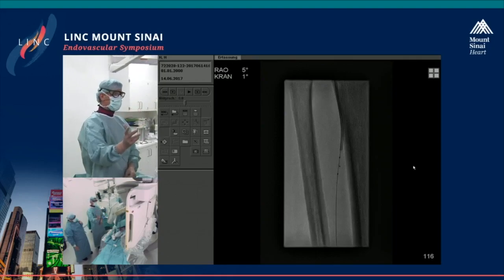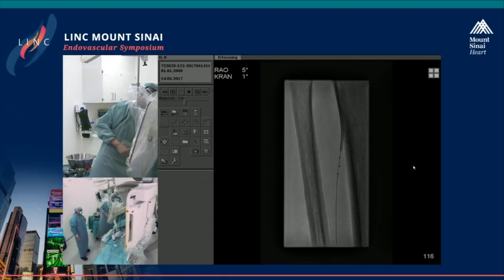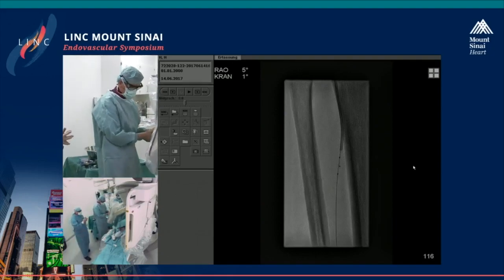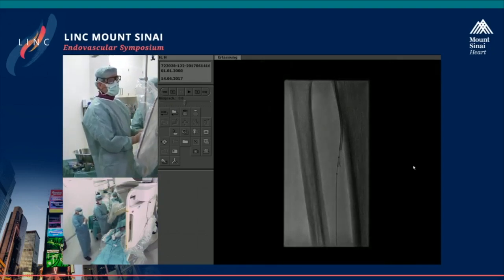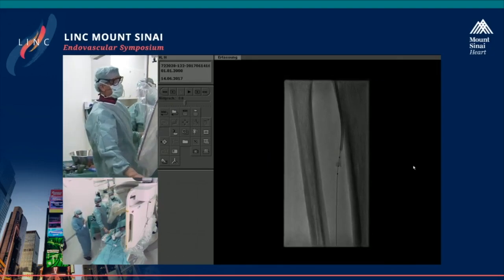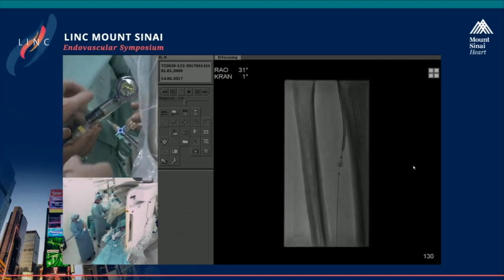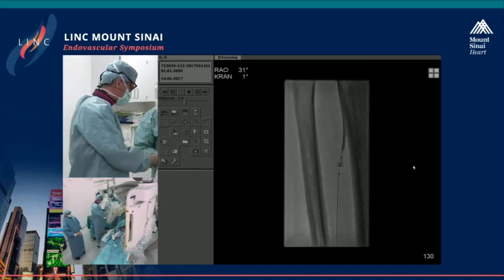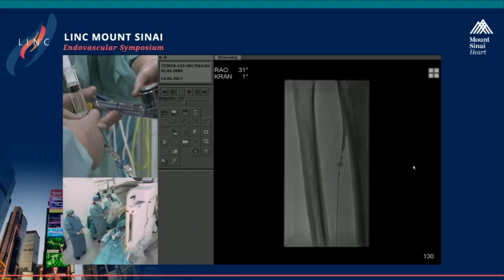Distal and proximal is the end of the balloon, and in the middle, this indicates where the needle will go out. And when I inflate the balloon now with not more than 2 atmospheres, there's a valve to open. So you can see here now the 2 markers in the middle portion, they separate from each other. And now the needle should be in the arterial wall.